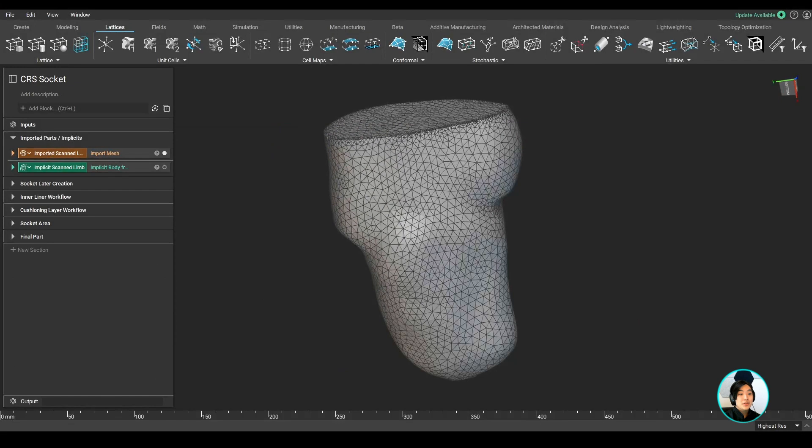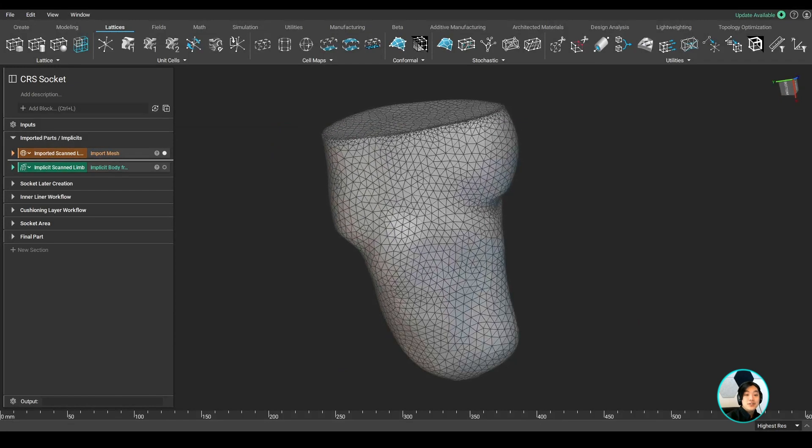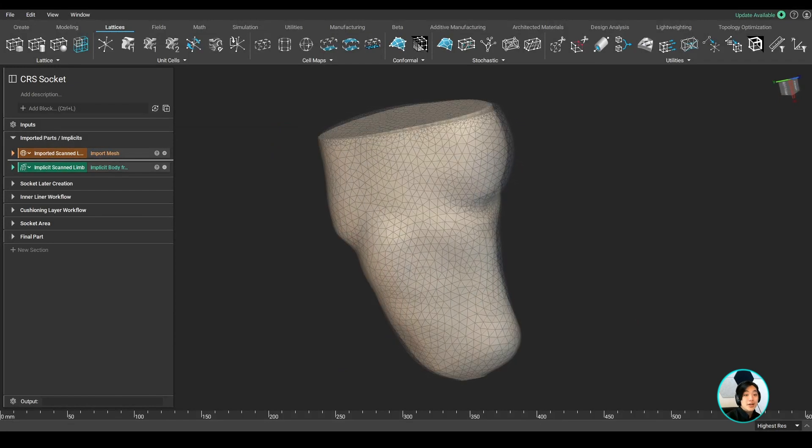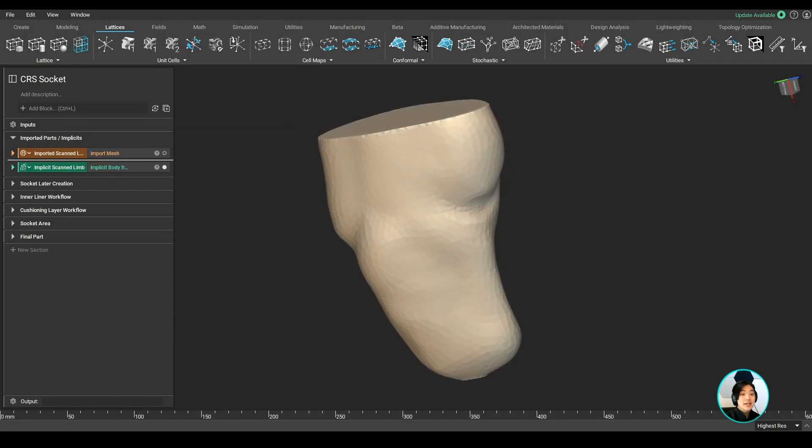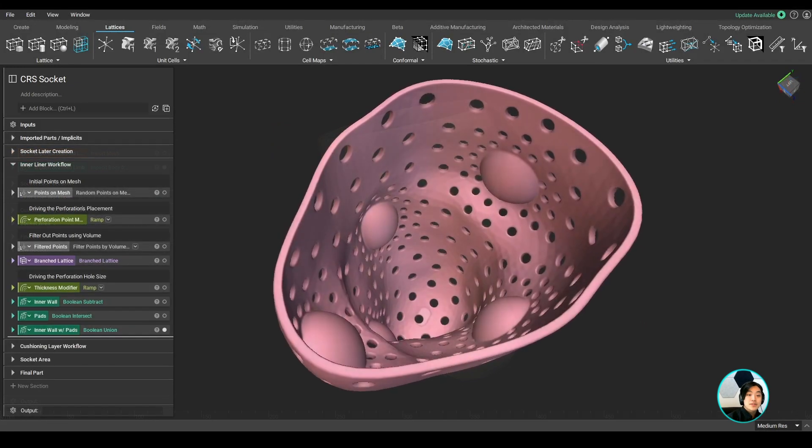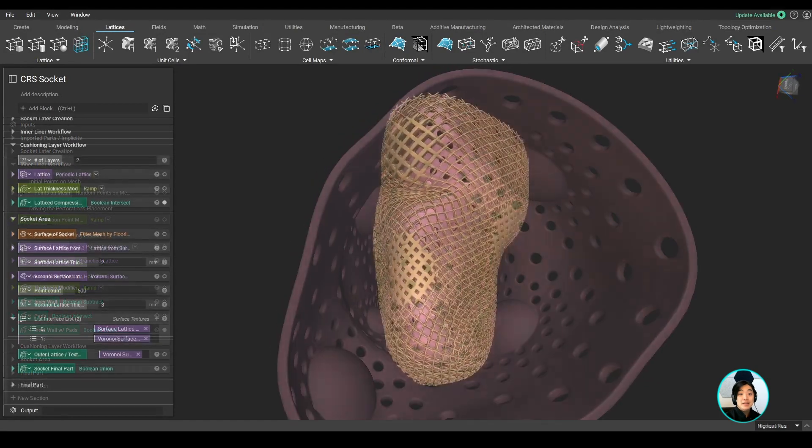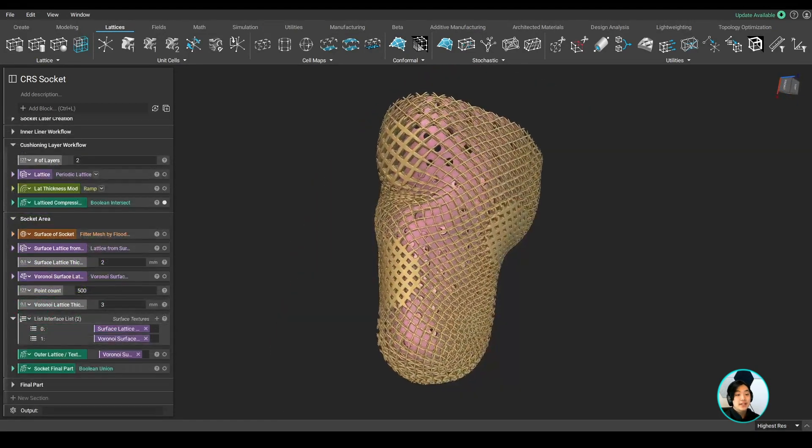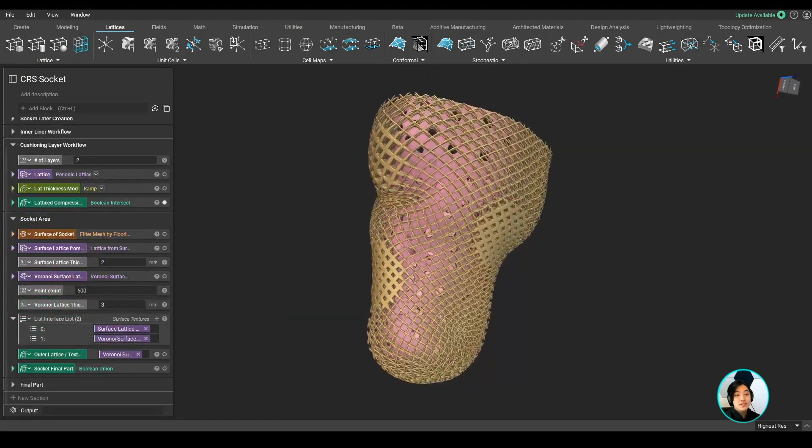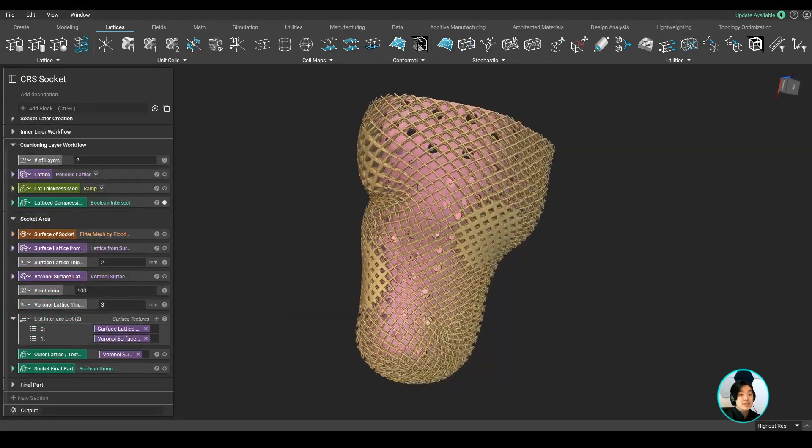To wrap things up, we imported mesh and turned it into editable geometry, smartly placed points to create varying perforations, and made varying thickened lattices conform to the surface of the prosthetic socket.